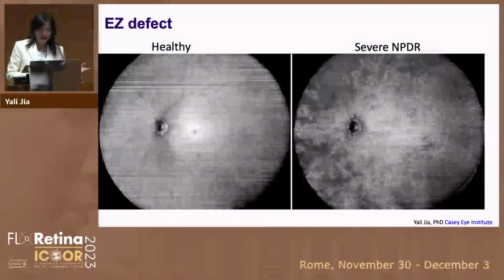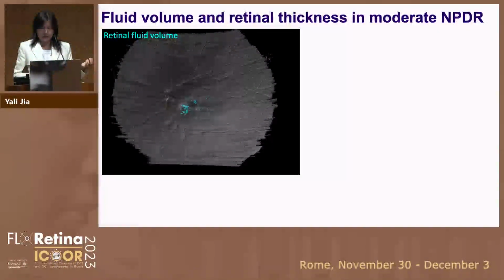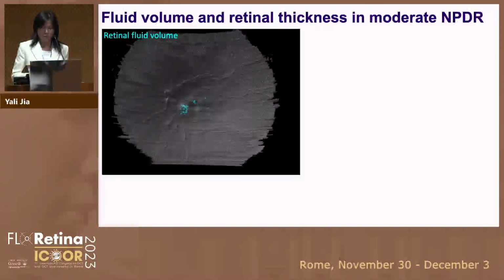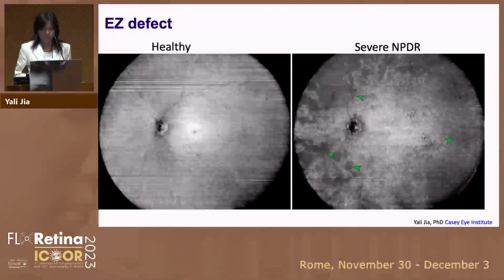Oh, going back here, I want to emphasize again the usefulness of deep learning. We also applied a published retinal fluid detection algorithm using deep learning on this new scan, which the neural network had never seen, but it still worked. We still detect the right position.